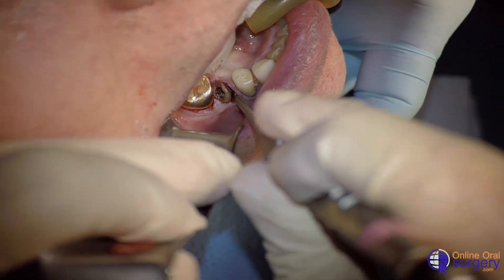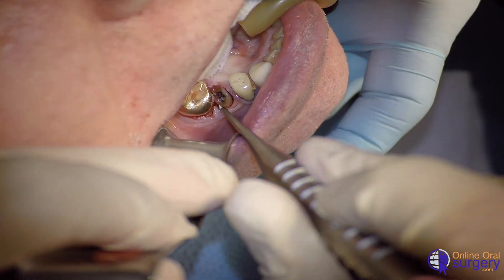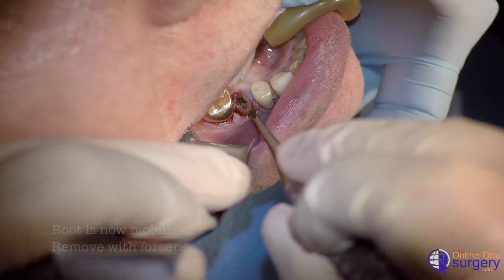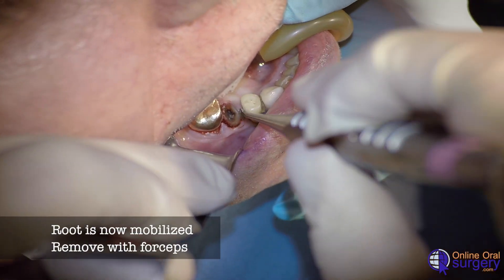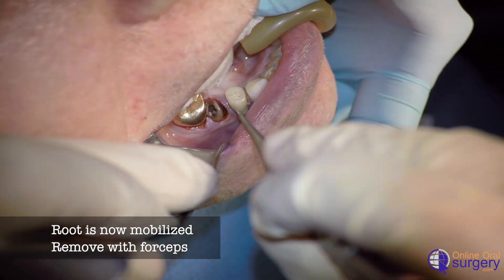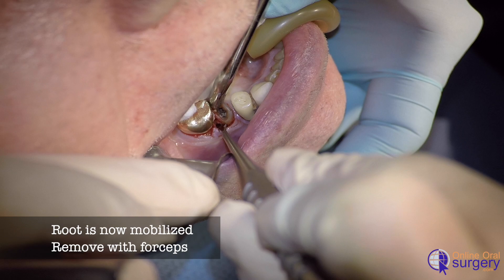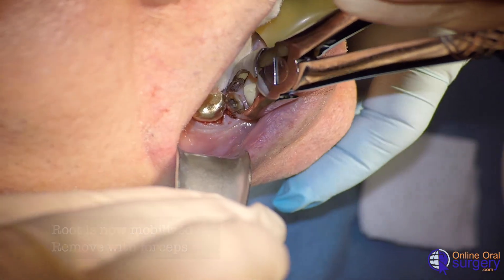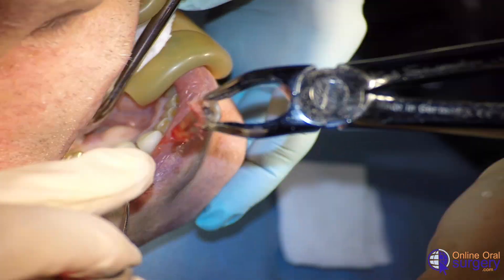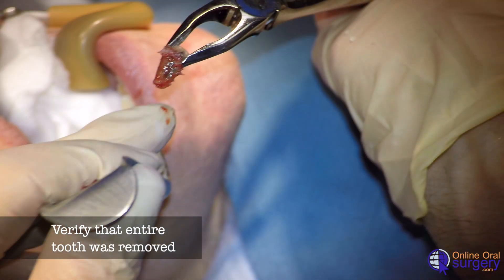Now we can put in our approximator, and we notice we've got significantly more movement of the root. We can take our approximator tip and move it towards the apex of the root, which will displace it to the point that we can come in with our forceps and easily and atraumatically remove that root from the socket. And we can see that it's completely clean.